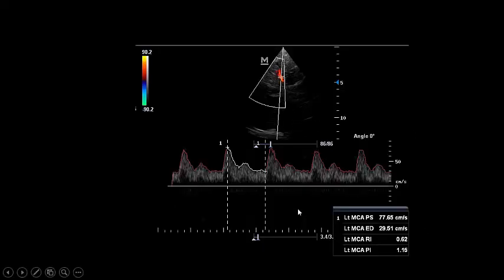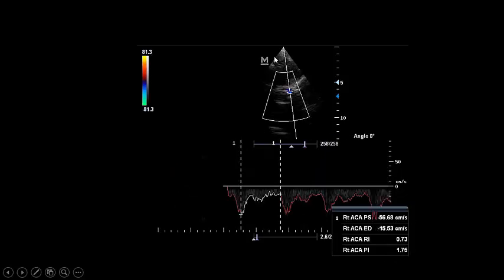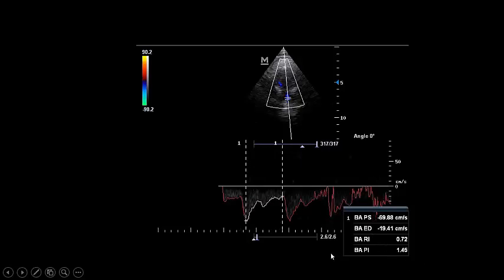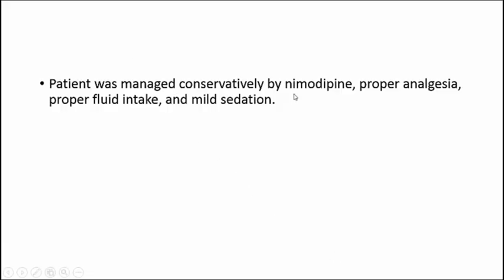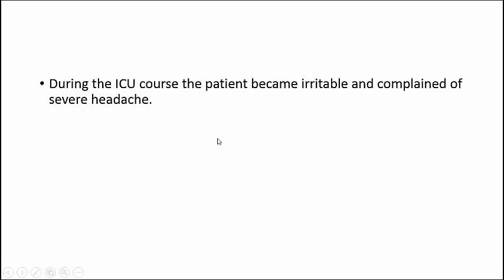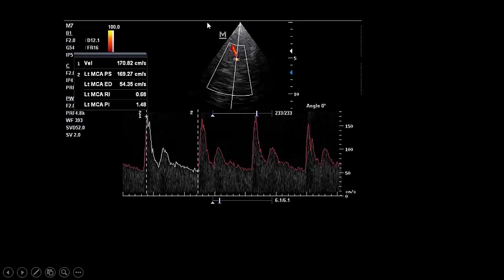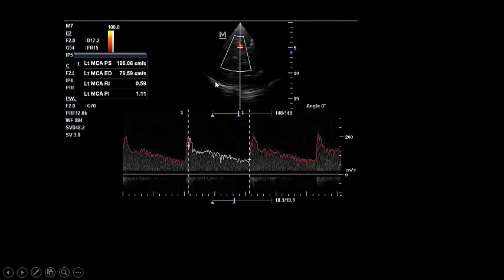We perform baseline cranial ultrasound for any neurocritical case admitted to our ICU — head trauma, stroke, subarachnoid hemorrhage — to have a baseline for comparison. The baseline showed left middle cerebral artery velocity 77 cm/s with PI 1.15, right anterior cerebral artery velocity 56 cm/s, basilar artery velocity 69 cm/s. During the ICU course, the patient became irritable with severe headache. Repeat TCD showed left middle cerebral artery velocity increased from 77 to 170 cm/s, then to 196 cm/s on further follow-up.